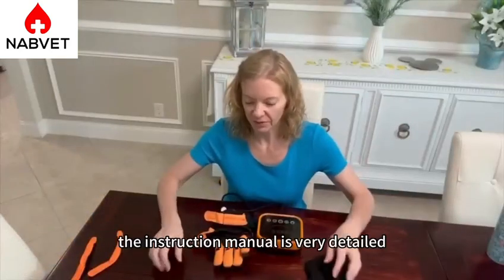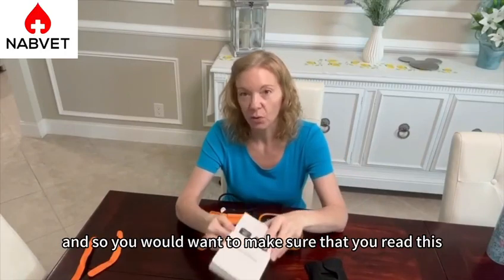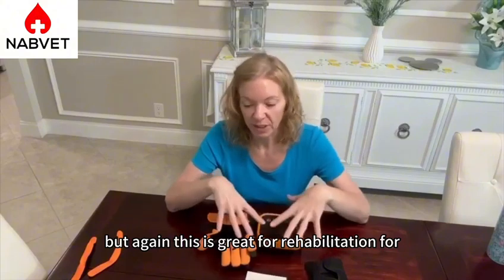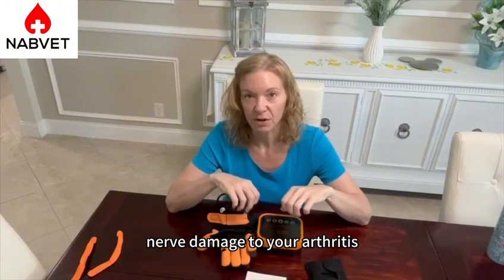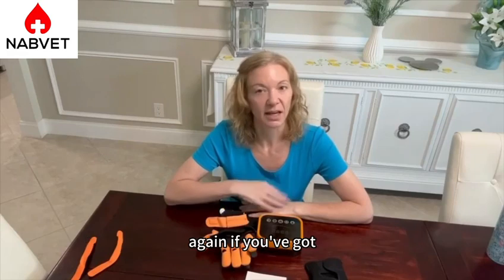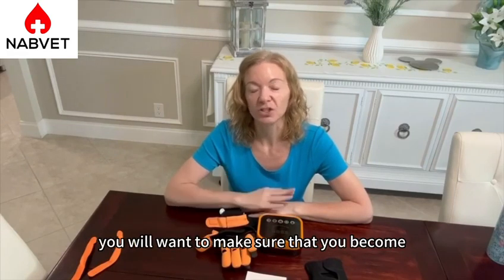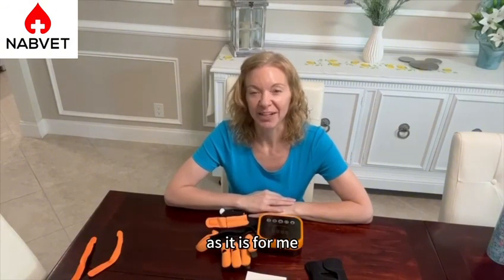The instruction manual is very detailed and it does instruct you on how to use the other modes, so you want to make sure that you read this very carefully before using the glove. This is great for rehabilitation, for hand injuries, bending, nerve damage, severe arthritis, and it really is a fantastic way to rehabilitate. I really hope that you get great use out of this. Again, if you've got any fractures or injuries that are unexplained, you will want to make sure that you contact your physician first. But I really hope that this is as useful to you as it is for me. Thanks so much for watching.